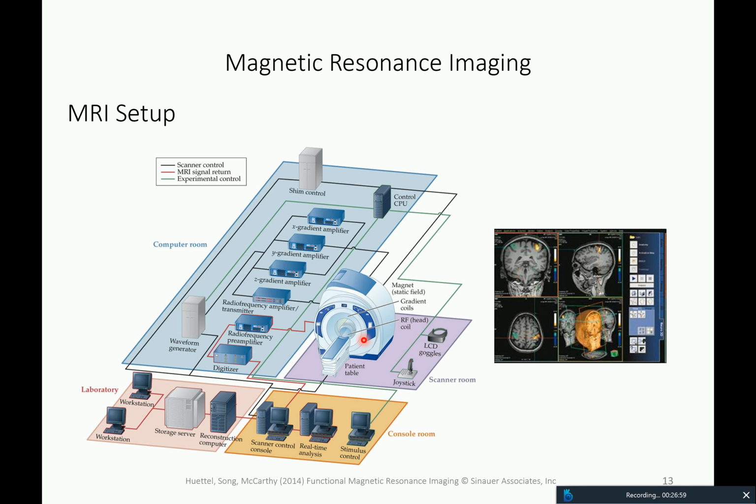So that's 250,000 a year, which is money that you don't spend on EEG, for example. There's no maintenance contract for EEG systems. Of course, you have some guarantees, and they repair your EEG system, but you don't have to pay just to have the machine there running.